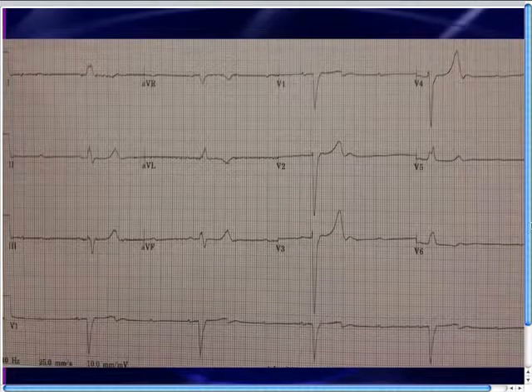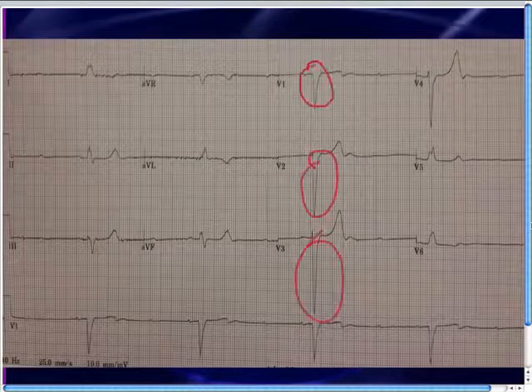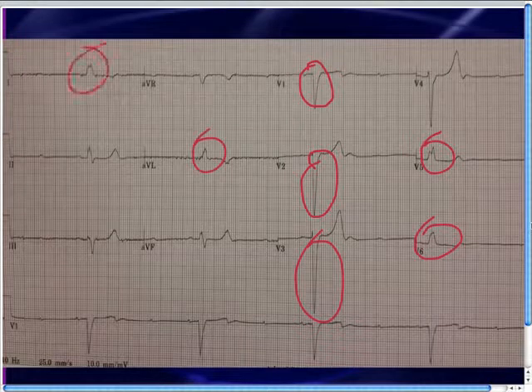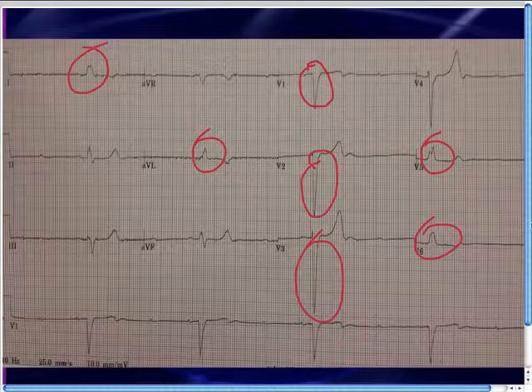You also notice the QRS is kind of wide, right? And when you've got a wide QRS, there's a differential that we've talked about before, but we're not going to spend too much time on that. There's a little r deep S wave in V1, V2, V3, and there's monophasic R waves in the lateral leads. In other words, there's no Q waves out there. And this would meet the definition of a left bundle. So this is, just as an aside, a combination of a left bundle with a Mobitz 2.